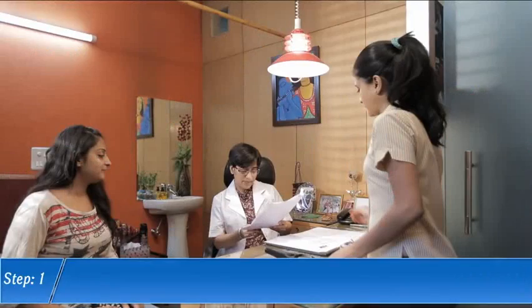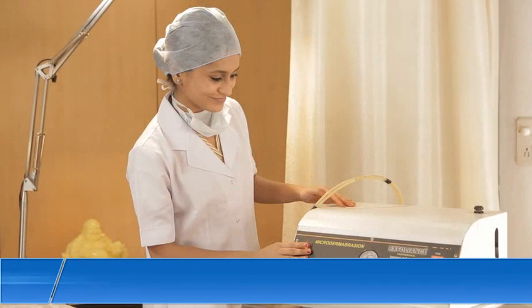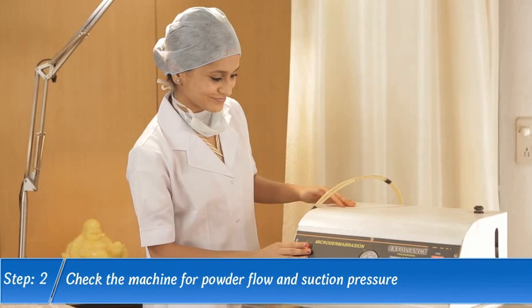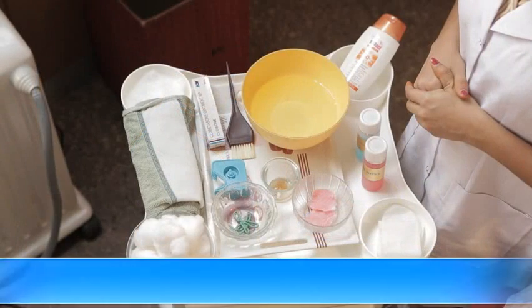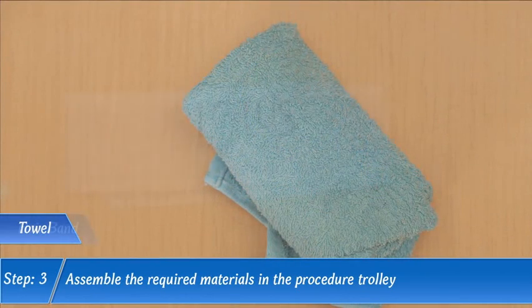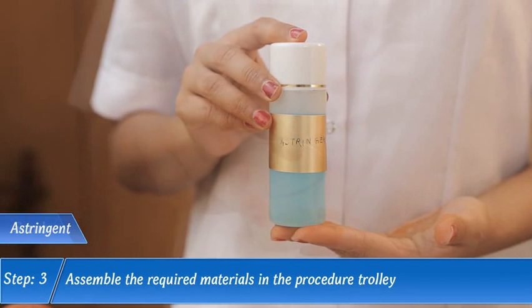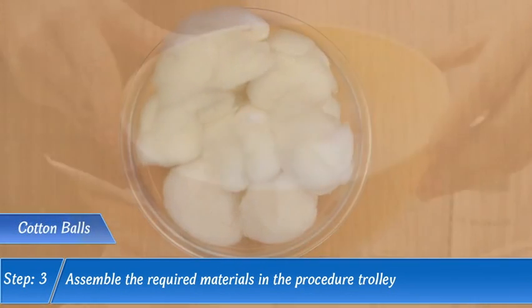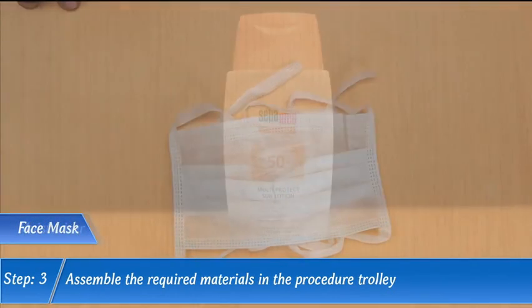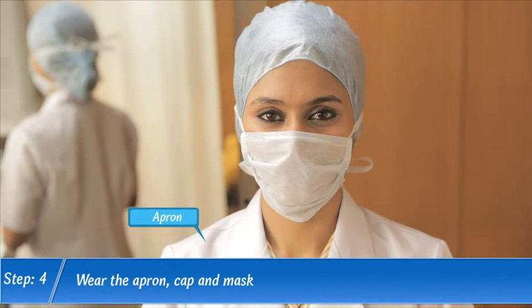Step 1. Step 2. Check the machine for powder flow and suction pressure. Step 3. Assemble the required materials in the procedure trolley. Step 4. Wear the apron, cap and mask.